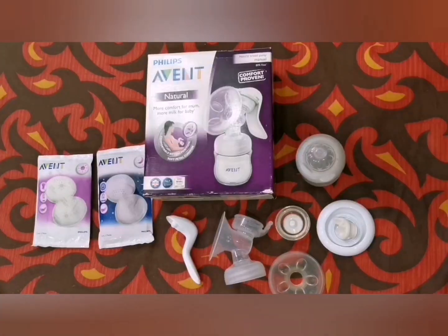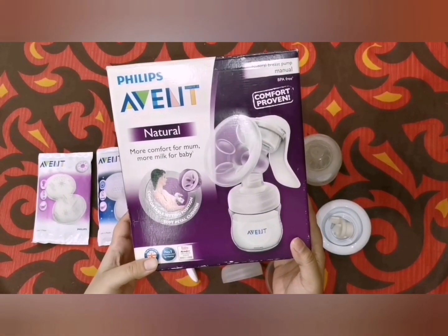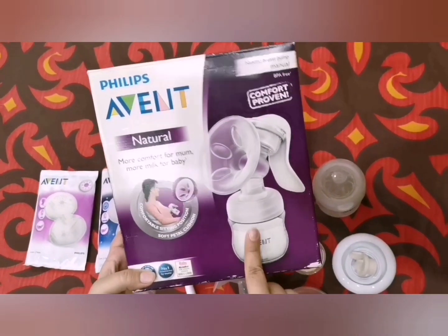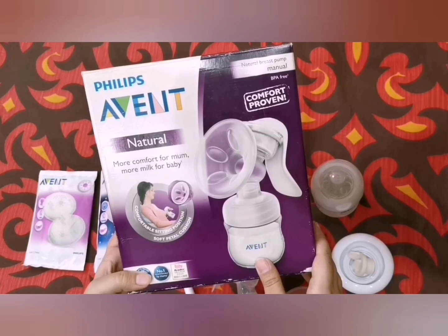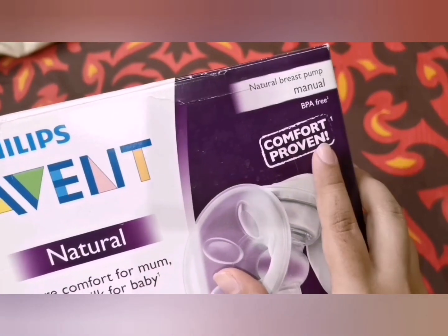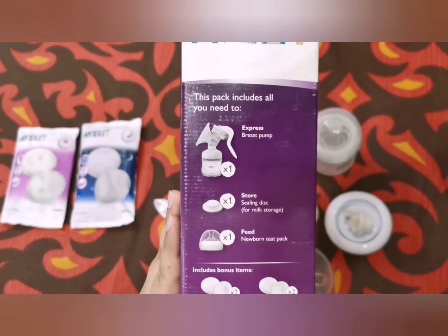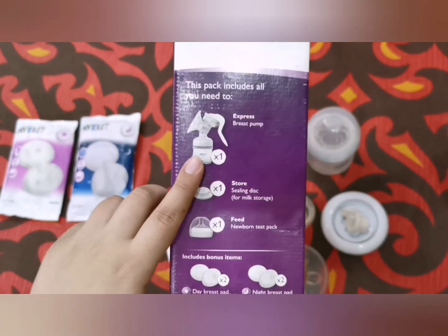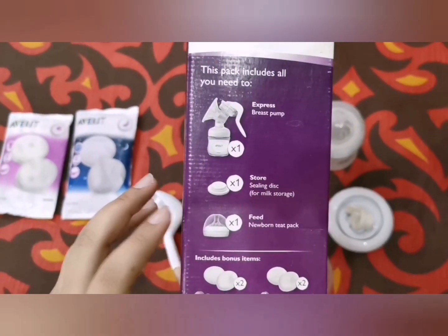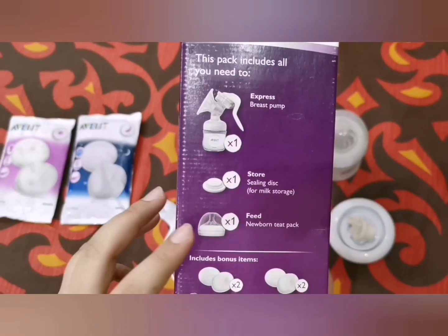Let's read what the packaging says. This is the Philips Avent natural manual breast pump, which is BPA free and comfort proven. This pack includes one manual breast pump, and for storing there is a sealing disc, and for feeding there is a four-ounce bottle along with a zero-to-one-month teat.